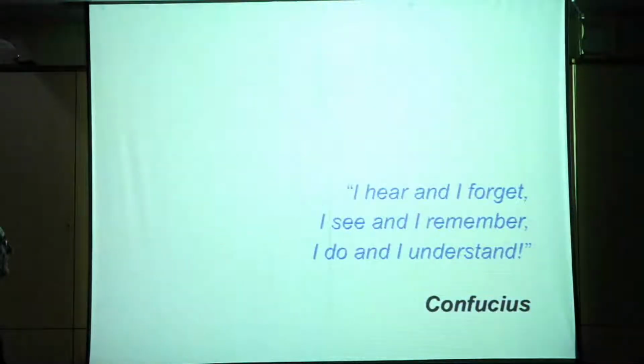These are the main artifacts that we can encounter in 3D echocardiography. Questions about that? No. Okay.